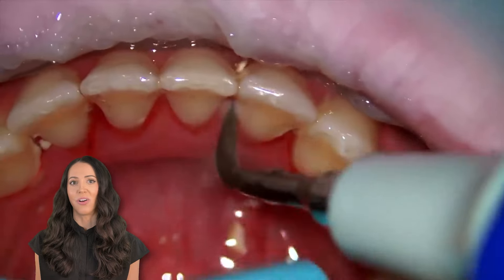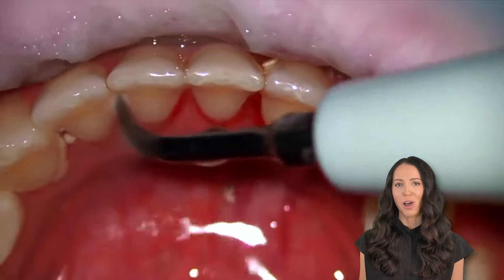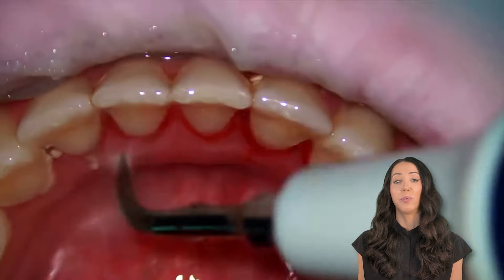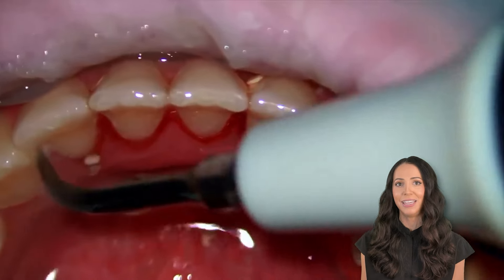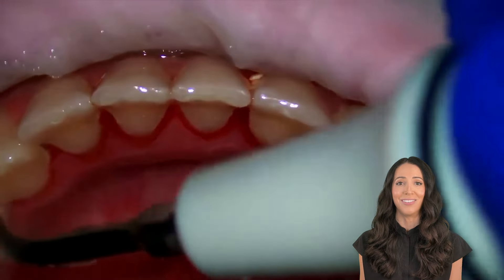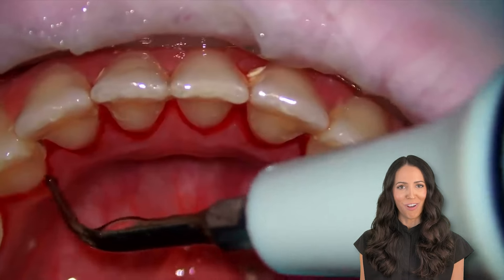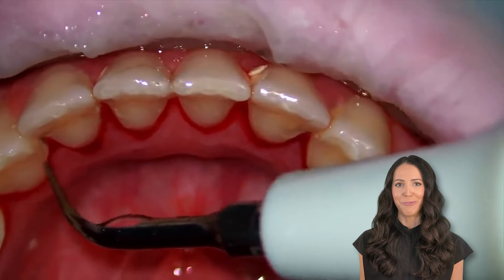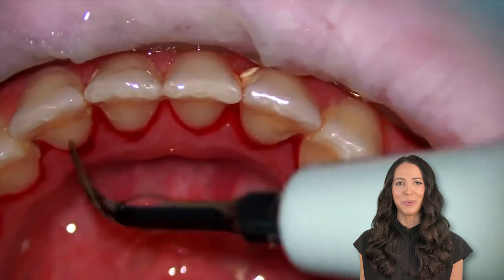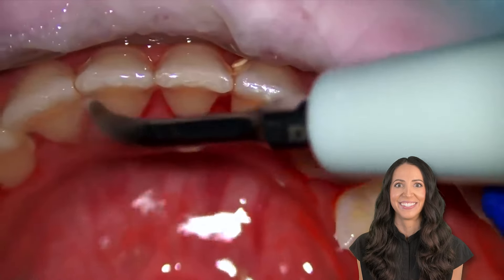So what we've been seeing here — this scaler that is being used — is called an ultrasonic scaler. It uses a combination of high-pressurized water and ultrasonic vibrations to remove tartar, plaque, and stain from the tooth surface. It's super gentle on the teeth, and it's extremely effective at cleaning around and below the gum line as well. It's like a water lavage, spraying away bacteria from all the little nooks and crevices between the teeth and around the gums. I love it. I'm sorry — I'm staring at it. It's just so satisfying.